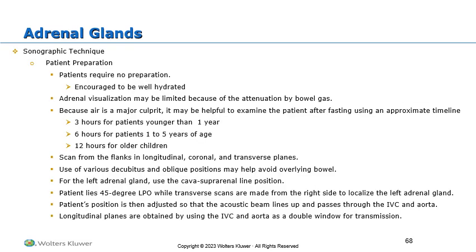Patient preparation for this, like with the kidneys, there's really no required preparation. If they can fast, that's fantastic. It might reduce the bowel gas. We do encourage patients to be well hydrated. That's going to cause the kidneys to appear better, which can help us see the adrenals better as well. Adrenal visualization could be limited, as you well know, because of attenuation by bowel gas. And with bowel gas causing the majority of our issues, it can be helpful to do the fasting, although again, it's not required.